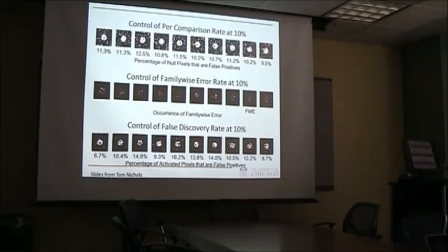And just visually, even if you forget about the details of how that works, what you can see if you compare this row to this row is that this is a lot more conservative method. Because we know, and again, this is the stuff that you in reality don't know, but in this example you know that anything within this red circle is actually activation. So in an ideal world, you would call everything outside black and everything inside white.